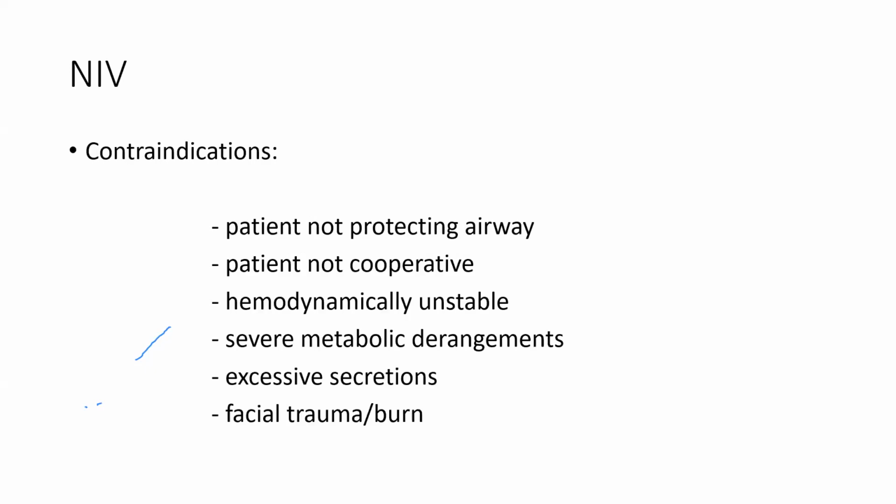This makes contraindications, in my opinion, to non-invasive mechanical ventilation more important than indications. So I would say simply, with no accuracy, that whenever a patient is not contraindicated to be on non-invasive mechanical ventilation, it's worth a trial on non-invasive, but a careful trial, and we will come to that. So contraindications to non-invasive mechanical ventilation, in contrast to indications, are multiple. These are just some examples.